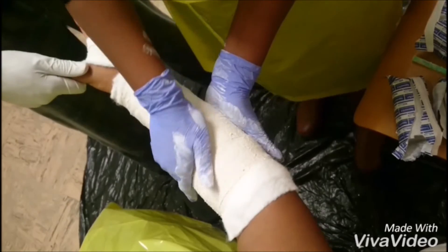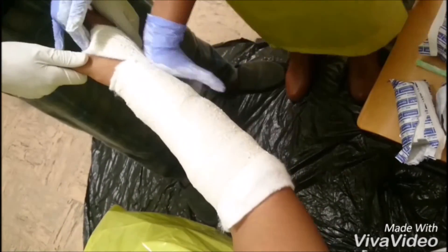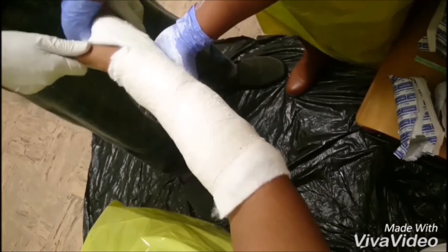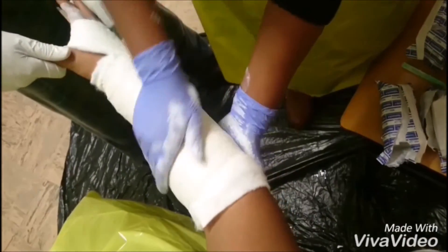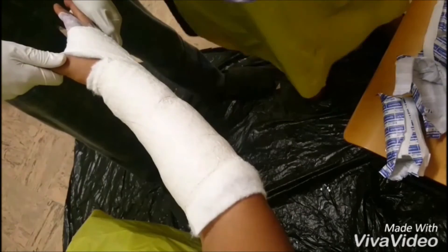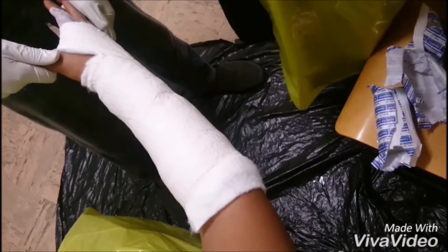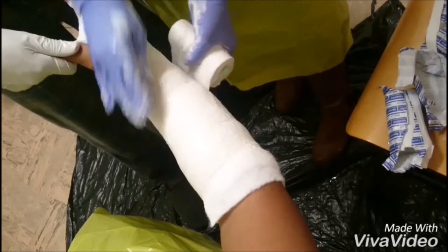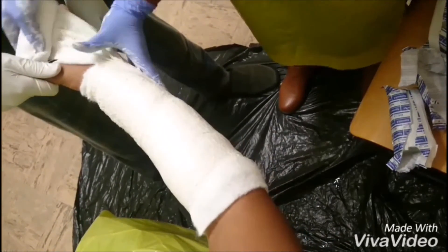With the second roll, start proximally and progress distally, ensuring that you fold the padding and cover it with the second layer. When applying the plaster, ensure that you smooth it with the palm of your hands and not fingers to prevent indenting of the cast. To ensure stability, use a total of 4 Plaster of Paris rolls. For this video, we only use 2.